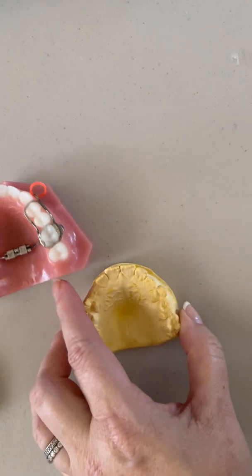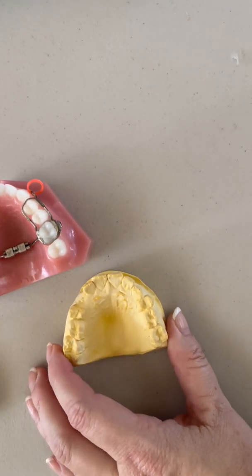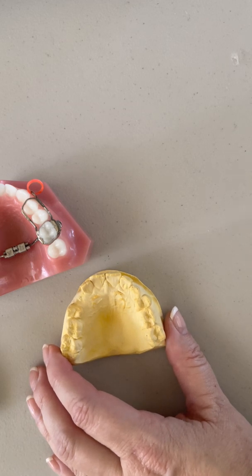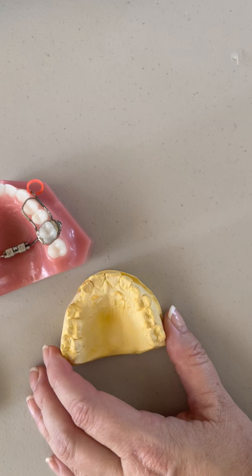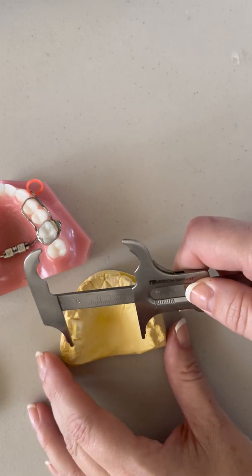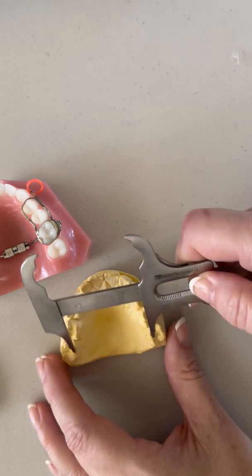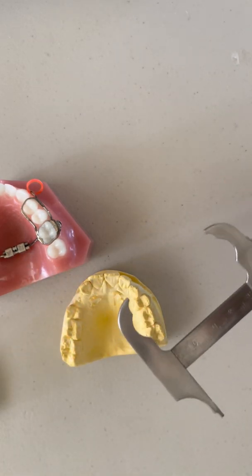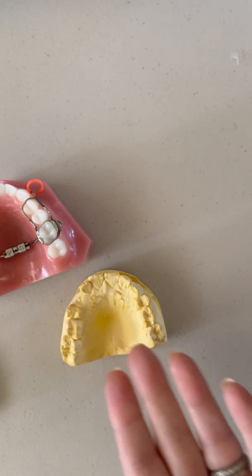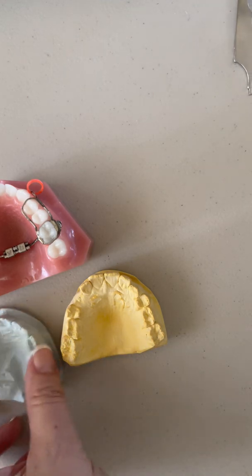This is actually my son, a little older. He did not have expansion but he did have some basic phase one orthodontics. We did not use an expander, although he probably got some arch expansion from that. You can see he's right on 40 millimeters — that's why I didn't use an expander. So you can see the difference.